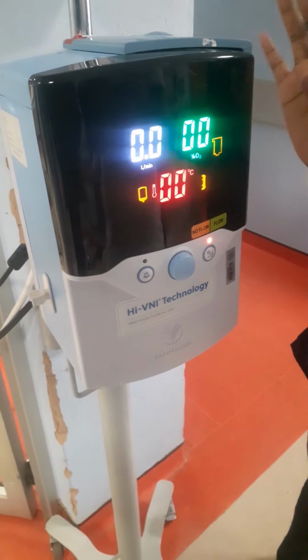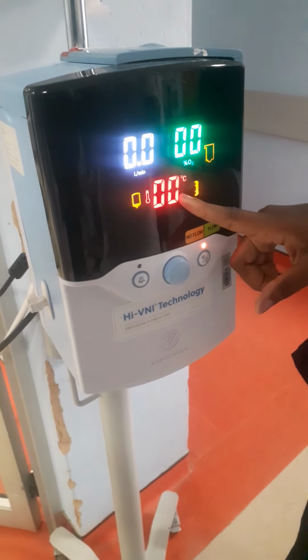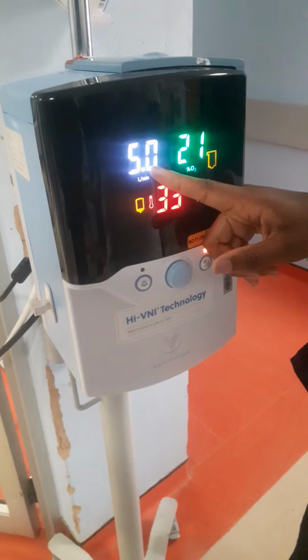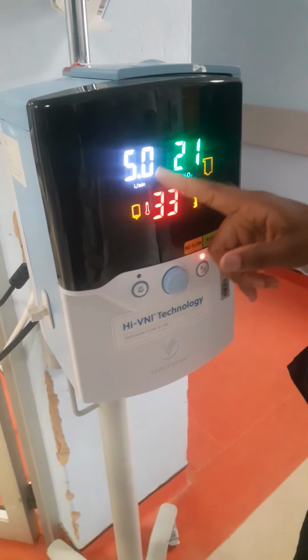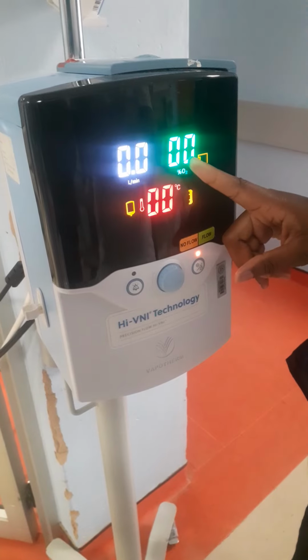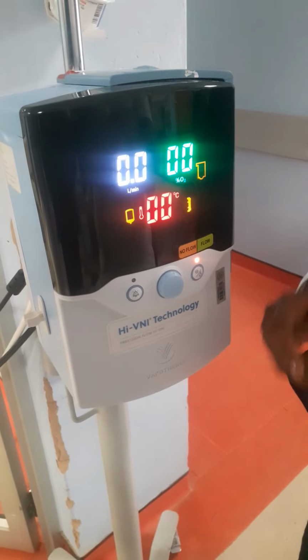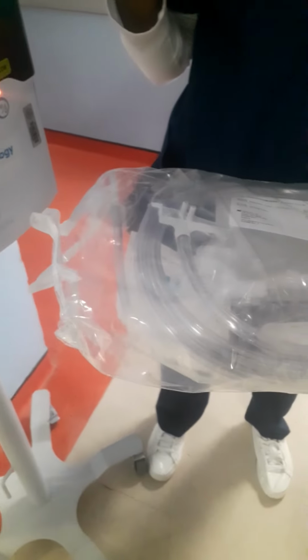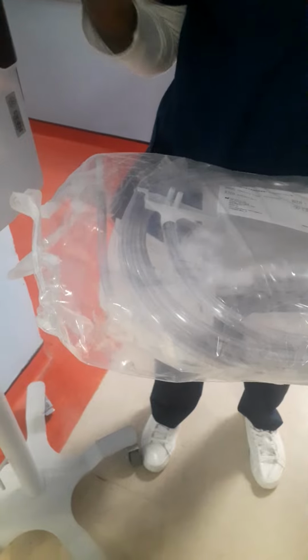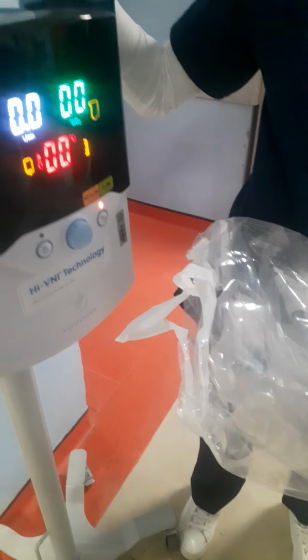So this machine, how it works is we have 3 parameters that we can set in it. We have our flow in liters per minute, then we have our oxygen concentration, and then we have our temperature. We talked about warm air; we call that humidification. Every high flow is supposed to have humidification.